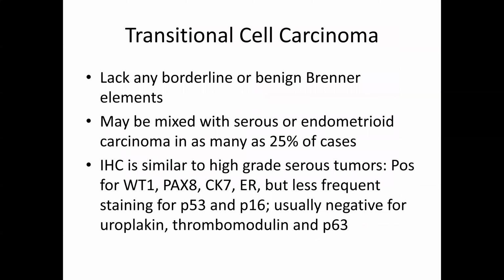Now, transitional cell carcinoma is reserved for any of those circumstances where we don't have any residual borderline or benign Brenner elements remaining. This can occasionally be mixed with other types of epithelium, serous or endometrioid. The immunohistochemistry, interestingly, tends to resemble that of the high-grade serous tumors.